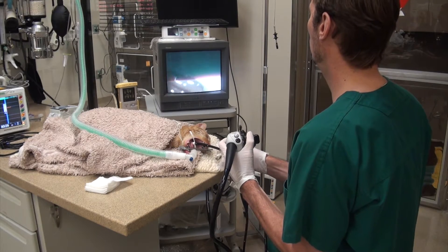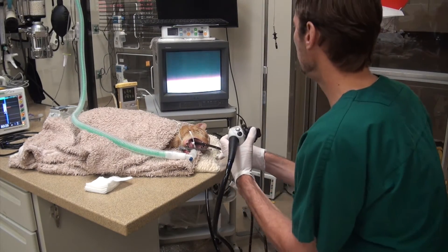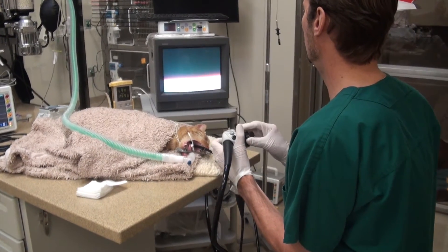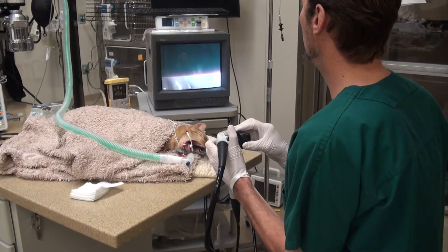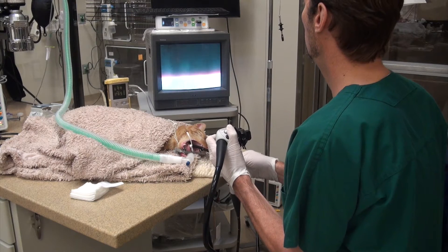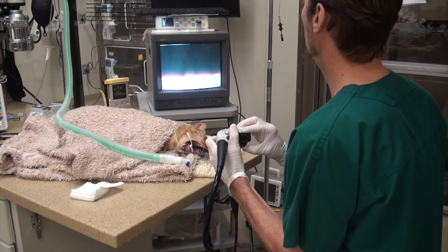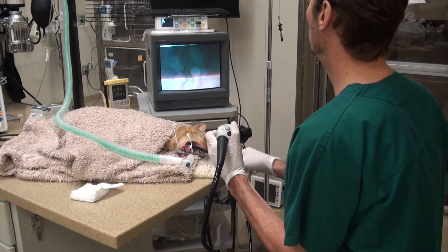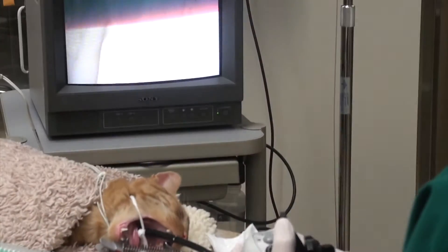So we're in the stomach now and we're going to inflate the stomach — see how this goes. I might have to have you hold the neck in a second. You can see the folds of the stomach right there. Looks like it's inflating everything. And actually there is the foreign body right there. So you can see that's the stomach inflated.